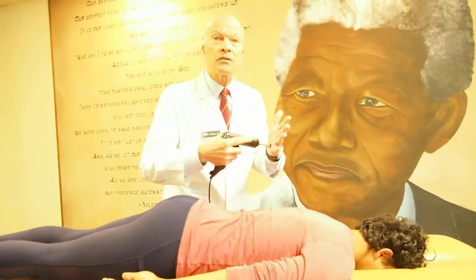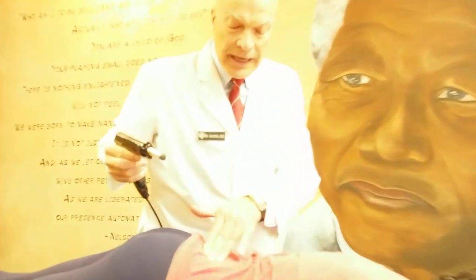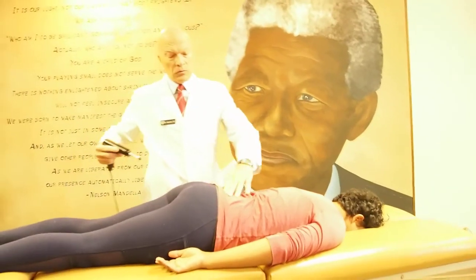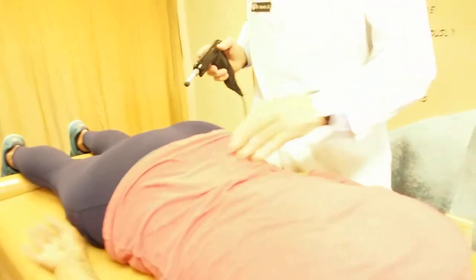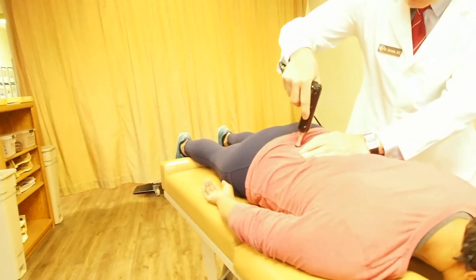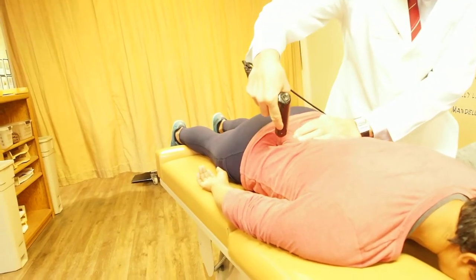We use a handheld instrument called the impulse device. I'm going to check her sacroiliac joints, because when we start forward running, leaping, and moving, we use the pelvic area. Is this tender? This can go out of alignment — if you look carefully, one side is more pronounced; her pelvis is torqued.